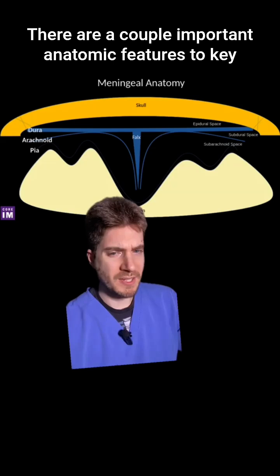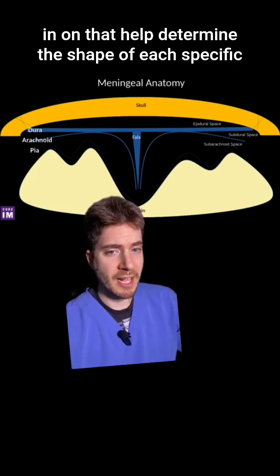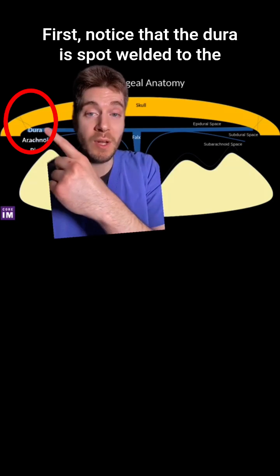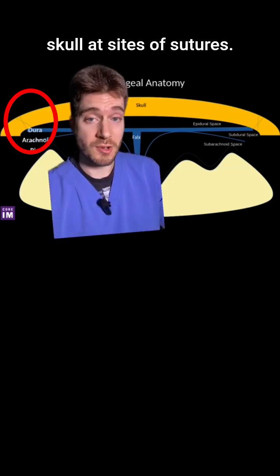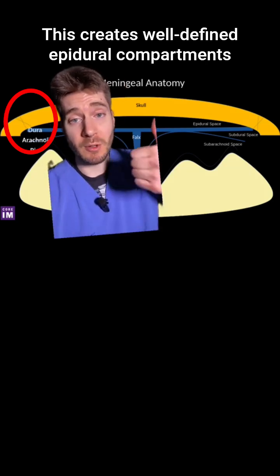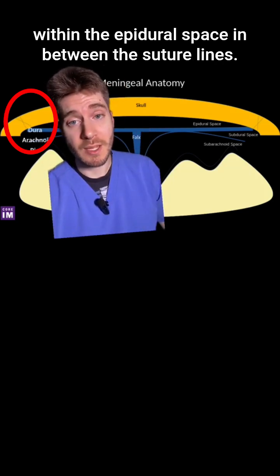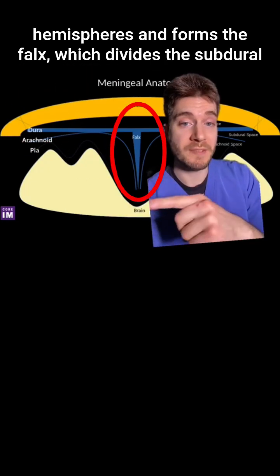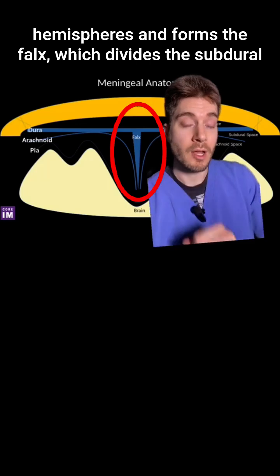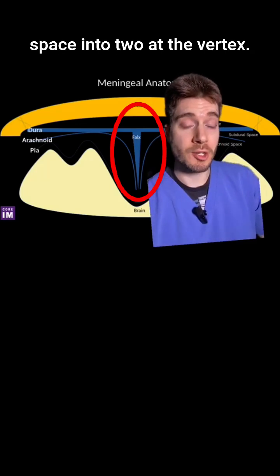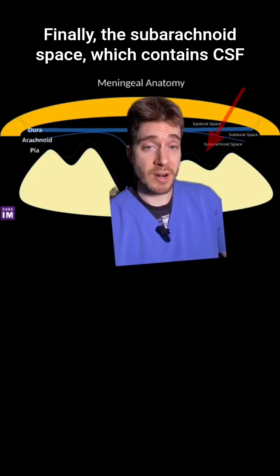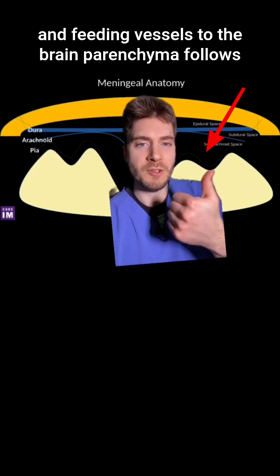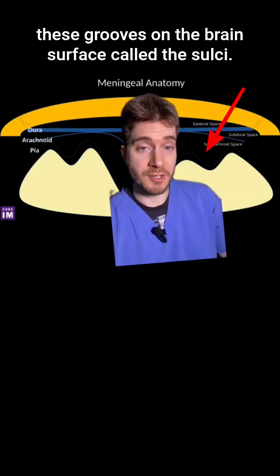There are a couple of important anatomic features to key in on that help determine the shape of each specific type of hemorrhage. First, notice that the dura is spot-welded to the skull at sites of sutures, creating well-defined epidural compartments within the epidural space between these sutural lines. Second, notice how the dura dives in between the cerebral hemispheres and forms the falx, which divides the subdural space into two at the vertex. Finally, the subarachnoid space, which contains CSF and feeding vessels to the brain parenchyma, follows the grooves on the brain surface called the sulci.